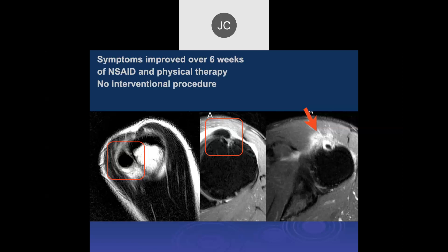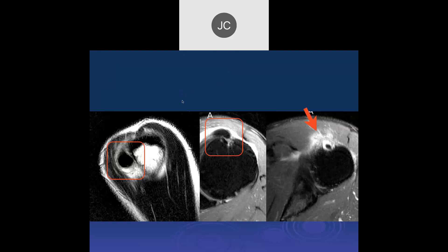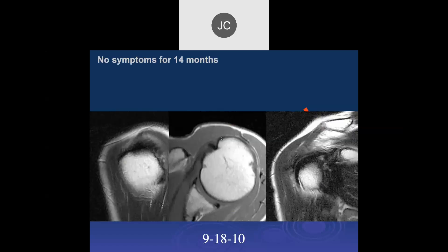This was treated non-surgically, and the pain went away over six weeks with non-steroidal anti-inflammatories and physical therapy. She refused any sort of interventional procedure, even though our interventional radiologist really wanted to do this. Then, 14 months later, she was asymptomatic — we brought her back just to see what it looked like. The previously noted calcification at the tendon insertion looks like it's pretty much resolved, and the edema has resolved.